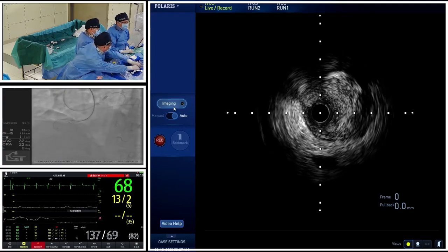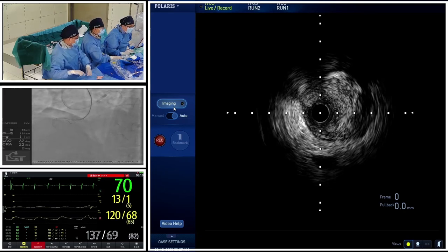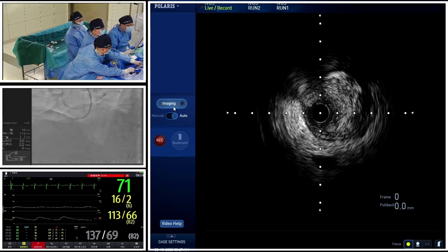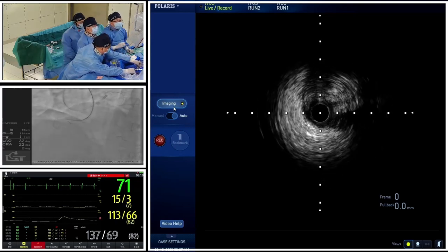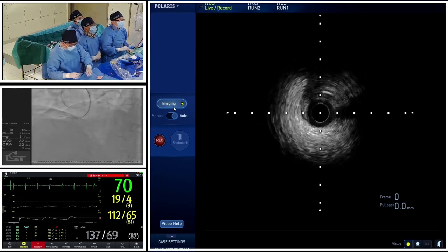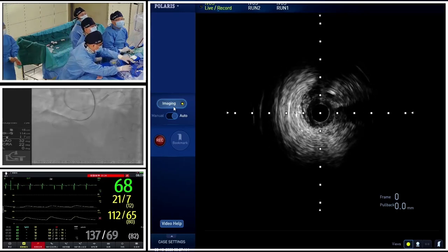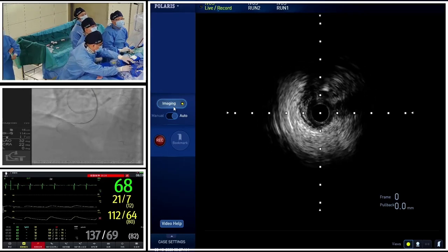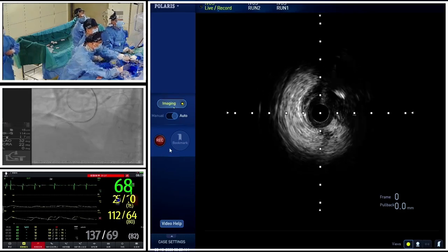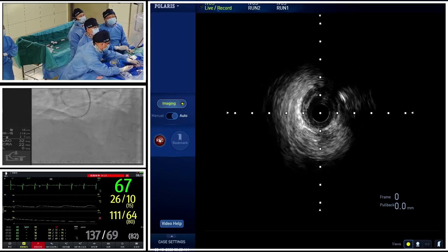Stop. Okay, we stop. Actually, each and every time Professor Li demonstrated the intelligent CT angiography reconstruction, it shocked me a lot. Absolutely. I think we passed through the spot. Okay, we can see some eccentric spots. Okay, should be in the right direction, within the architecture of the vessel. Yes, this is a good demonstration.